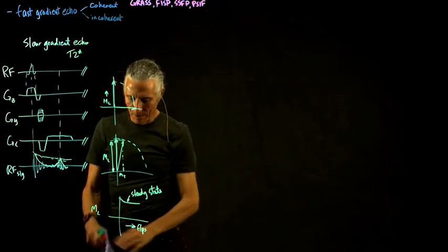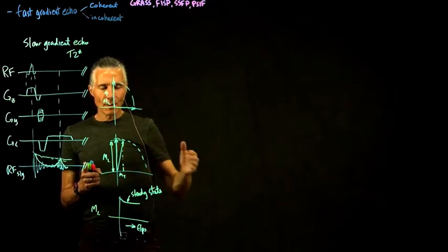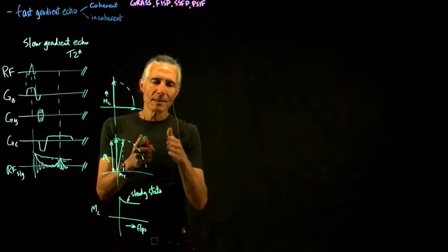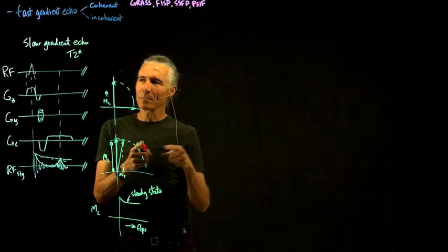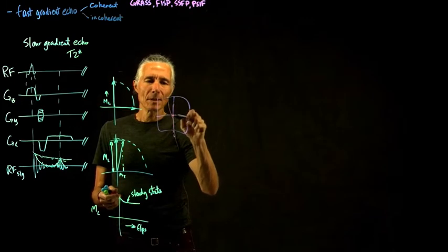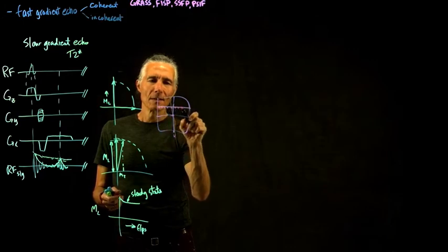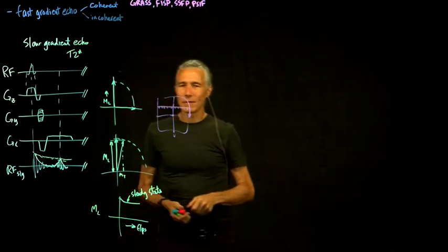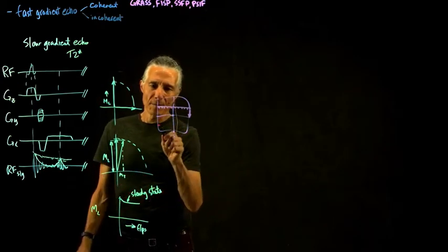So like in spin echo, what you do is you do a 90, and then you do a series of 180s, and when you're doing the 180s, you're recording data from K-space. But after you record a line of K-space, whatever line you went to, so if you for instance start in the middle and then ended up, after doing some stuff, recording a line of data here, then you have to go back to the 0 point, put everything back in order, so that you can record another line, and that other line might be maybe down here.